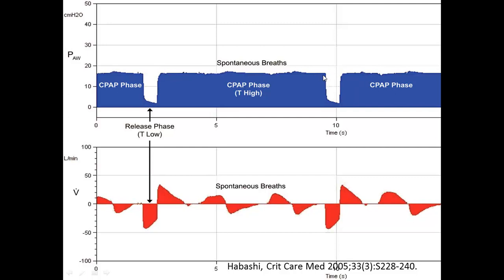These intermittent periods where the pressure is released are called the release pressure, or the release point, and it results in an exhalation of a given tidal volume. The tidal volume is variable based upon the delta P from P high to P low, based upon the patient's expiratory time constant, the resistance times the compliance, as well as the resistance applied by the exhalation valve.